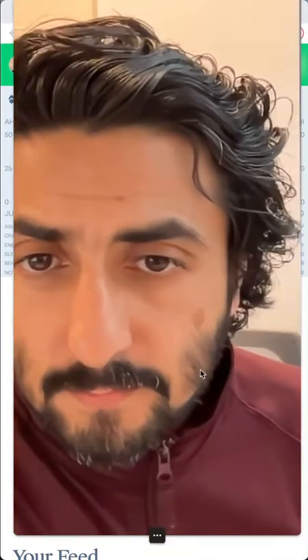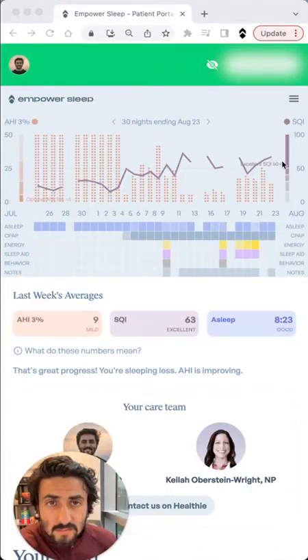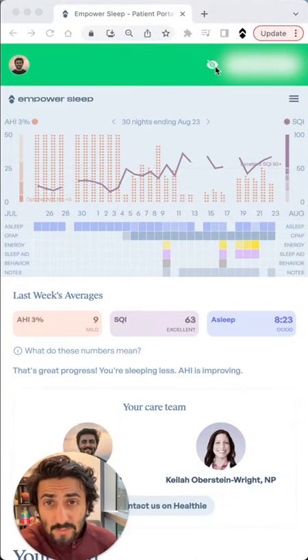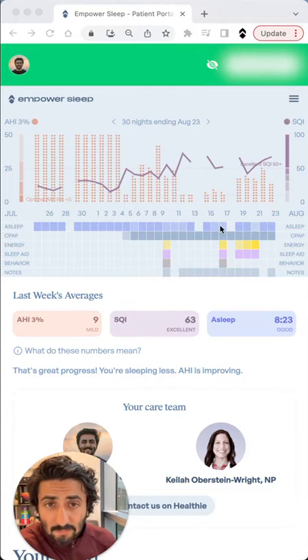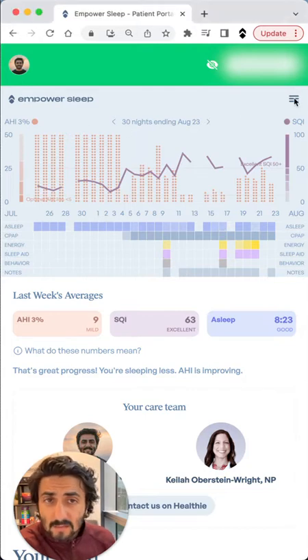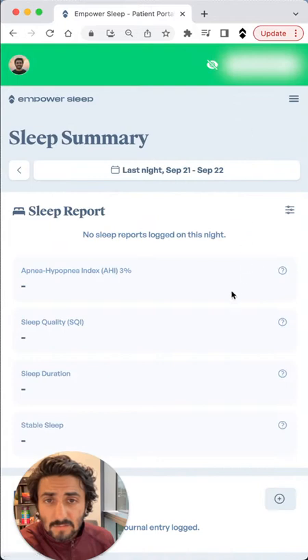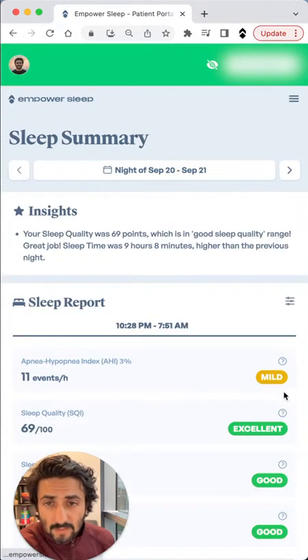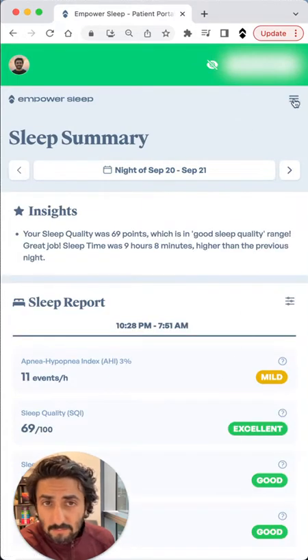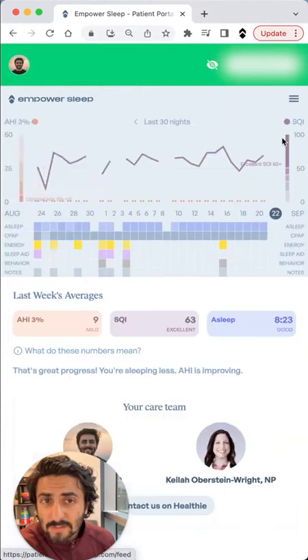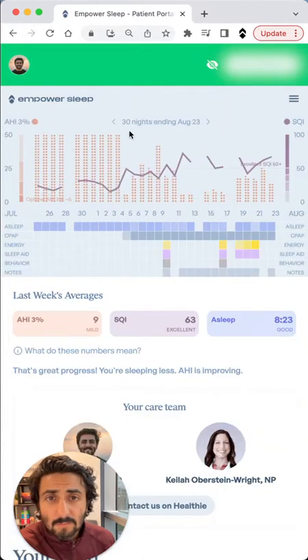So let me give you an example of what that means. This is an example of a patient dashboard through the mobile app. This is a 30-day window — they have a single day window where they can look at their data, but for the purpose of showing the value of this, I'm going to show you the 30-day window.